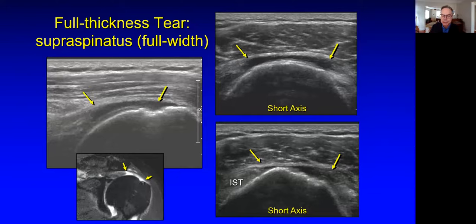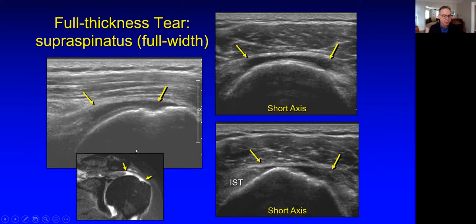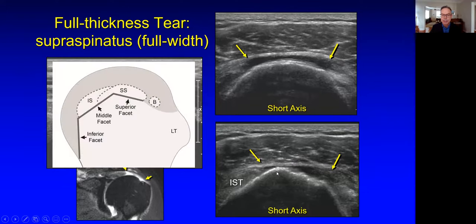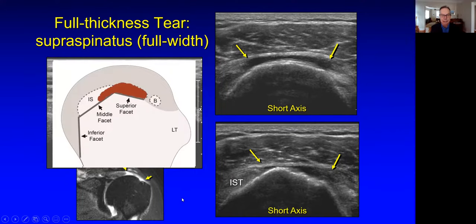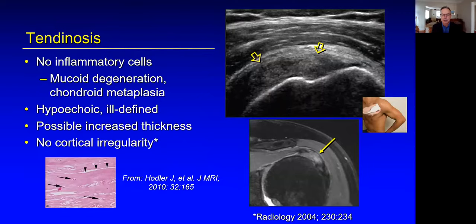Here is a larger full thickness tear — this one is full width, so you can see the degree of retraction. There's the cartilage interface sign, the cortical irregularity, and the flattening of the interface with the deltoid due to volume loss. Here it is filled with fluid on the MR. Looking on short axis and paying attention to the apex of the greater tuberosity separating the superior and middle facets, the entire supraspinatus is torn and retracted. So this is a full thickness, full width tear — another way to indicate that the entire tendon is torn.